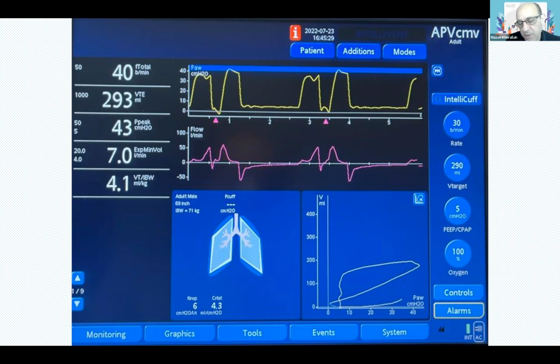The other thing you can do is sedate the patient in a better way, if you think that this is actually causing some asynchrony and you don't want to have stacked volume. Of course, in patients with ARDS, you don't want to have stacked volumes. And if this is happening very frequently, like what you see here, almost every other breath or every breath, that means you're not giving the patient protective lung strategy. So if you cannot eliminate this by prolongation of the inspiratory time on the ventilator, at that time you need to sedate the patient deeper.